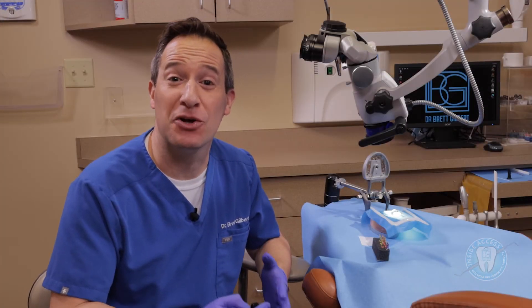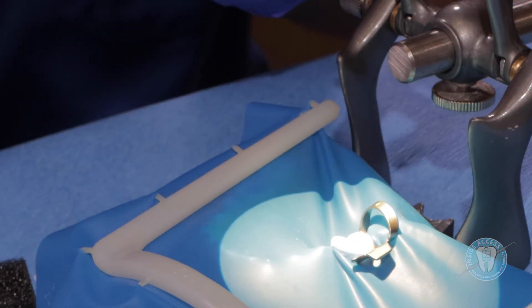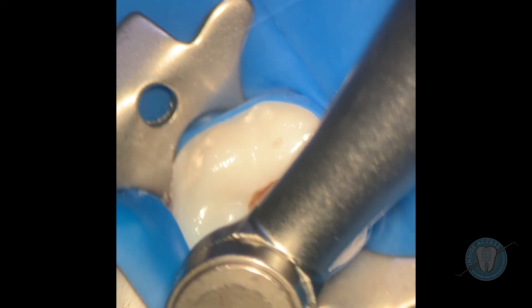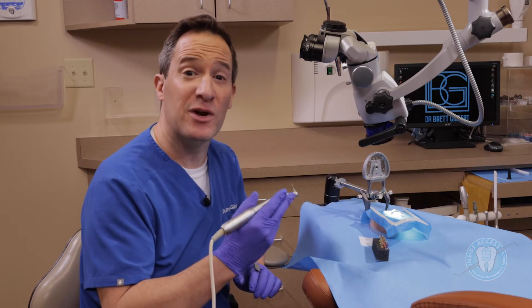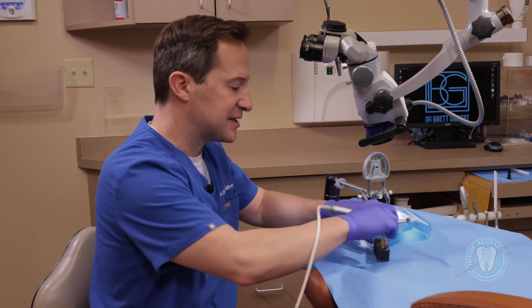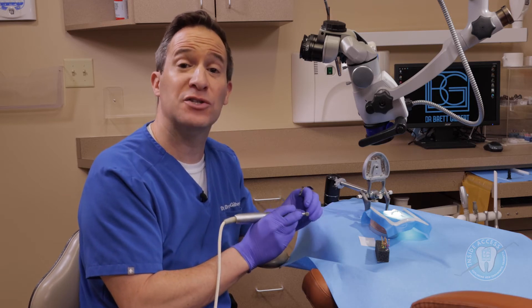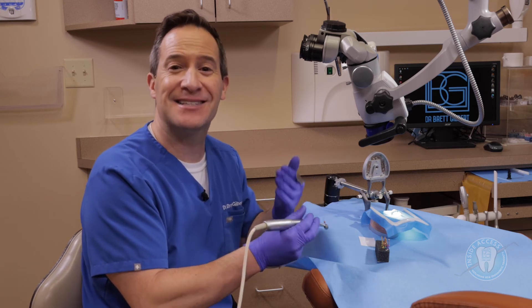We're here in a clinical simulation setting to take a look at the Kerr products. We're going to start with the Traverse and the Zenflex file systems. We have our Traverse glide path file — this is the orifice opener, just going to be for coronal preparation. Always want to use a little lubricant. As I bring it in, I really like how you're able to just very smoothly insert it into the canal. It withdraws very nicely, it's very flexible, and it has a very reassuring feel as you're preparing that orifice opening. This glide path system allows you to really create a beautiful pathway without having to use a lot of hand files, which really takes a lot of the burden off of your fingers.